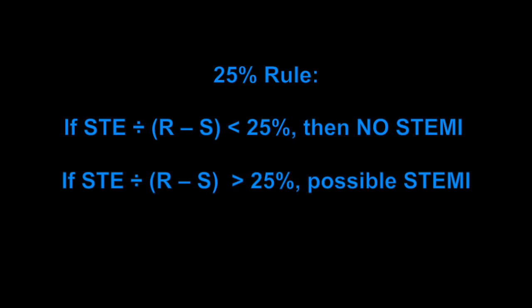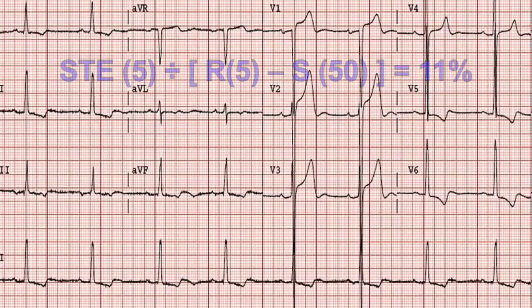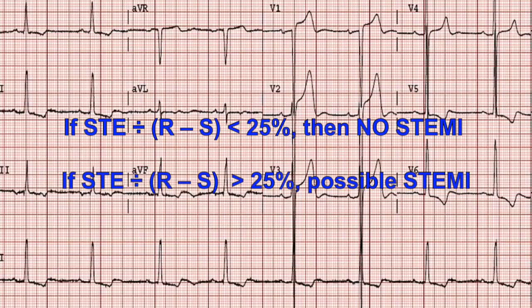Let's take a look at this EKG. There is an S wave in V1 plus the R wave in V5 that measures greater than 35 millimeters, so there is left ventricular hypertrophy. We can see some ST elevation in V2 and V3 that measures around five little boxes. The R wave in V2 or V3 is around five little boxes and the S wave is around 50. After doing all the math, it comes out to around 11%, so there is probably no STEMI in this EKG.